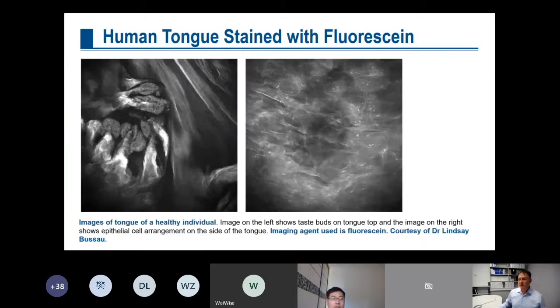These images were taken in the mouth following topical application of fluorescein. The microscopic structures, cells and subcellular details can be seen, although the way the dye stains the mouth is quite different to the way acriflavine does. A recent study in India found that fluorescein labels cancer in the mouth better than healthy tissue. We've not tested this yet with the endomicroscope, but expect to be able to do so soon.